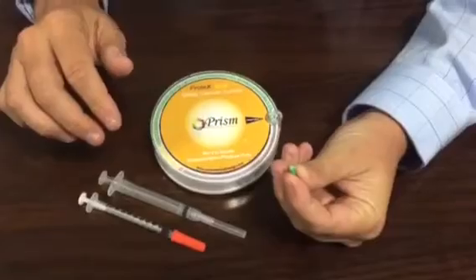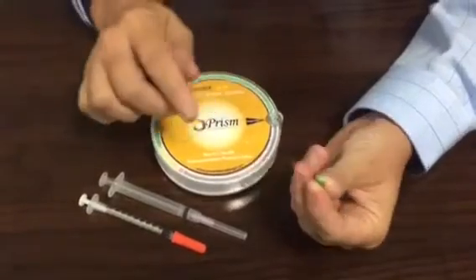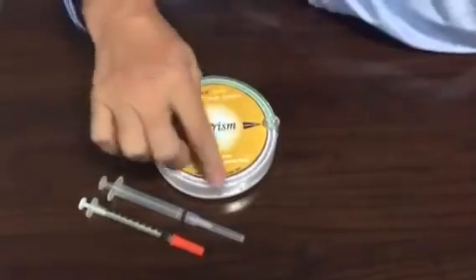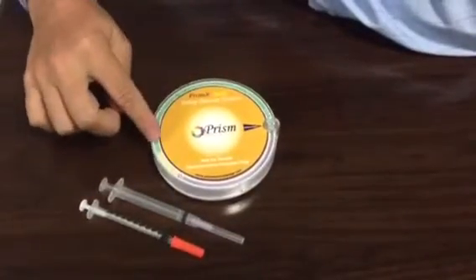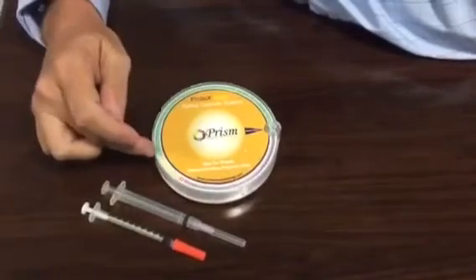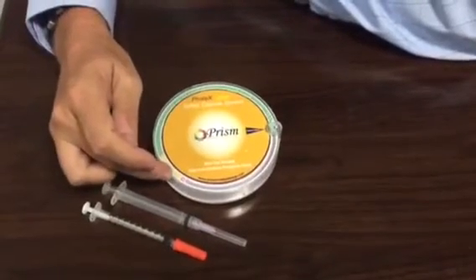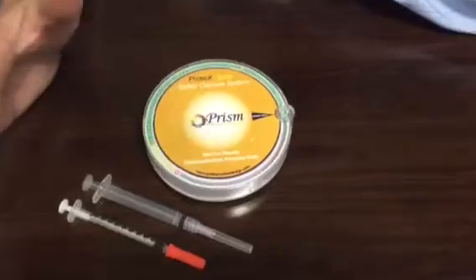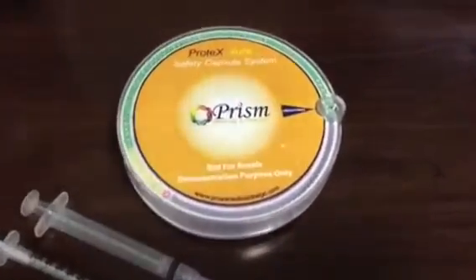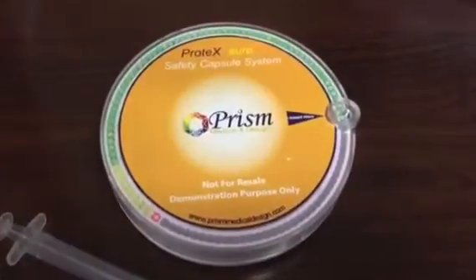We'll demonstrate in a second, but you stick the needle tip in, it comes out, and this covers the needle so you can't accidentally stick yourself. The first 90 capsules you can see here will be green — we've used a few here so it's actually empty. The next nine are yellow to demonstrate caution, you're running low on supply, and then the very last capsule will be red to indicate it's the last capsule and there's no more after that.